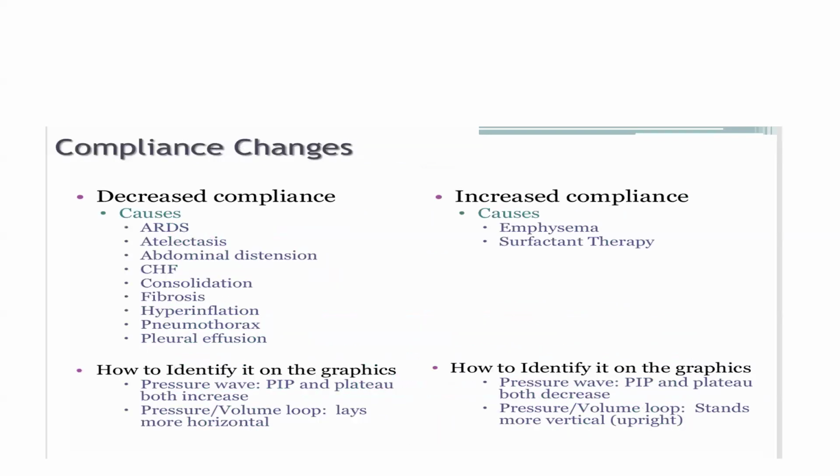Now, compliance change. Decrease in the compliance causes are ARDS, atelectasis, abdominal distension, congestive heart failure, consolidation, fibrosis, hyperinflation, pneumothorax, and pleural effusion. Increased compliance is caused by emphysema and surfactant therapy.